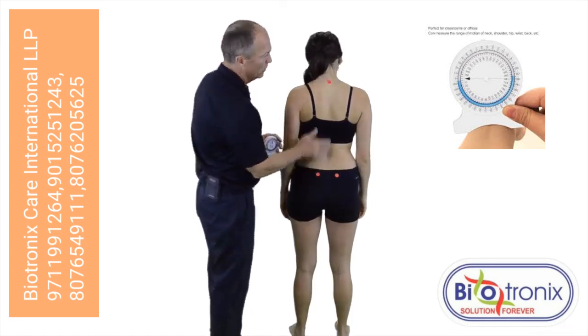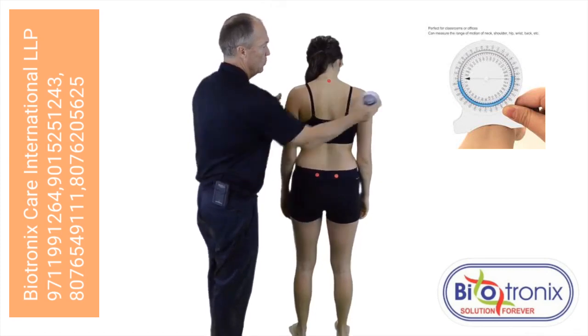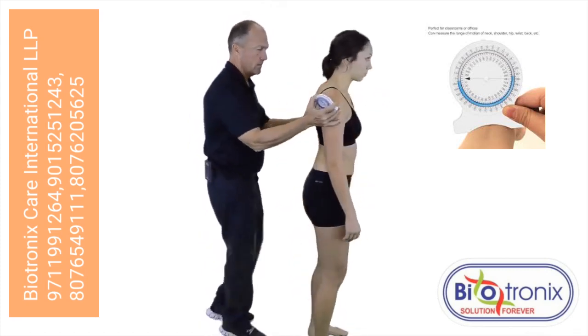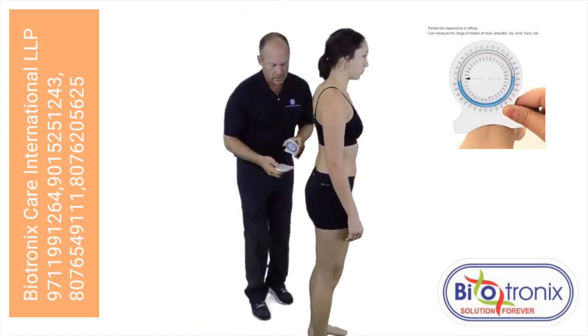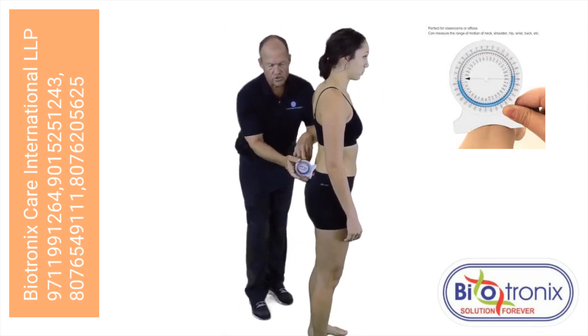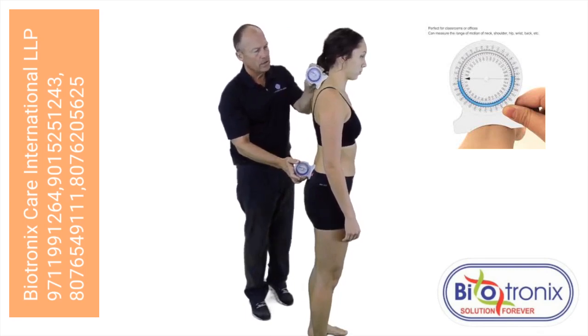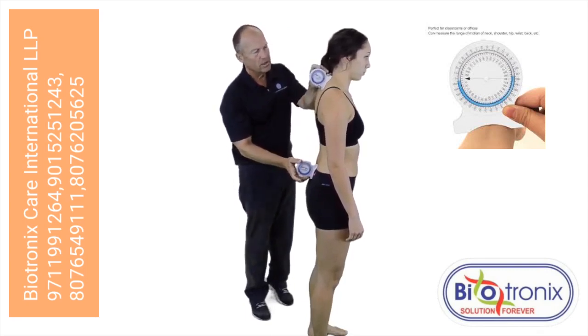Our second landmark will be over T1, and it would look like this. I would take the inclinometer identified over S2, zeroing out the inclinometer. I will take my second one and position it just above T1.